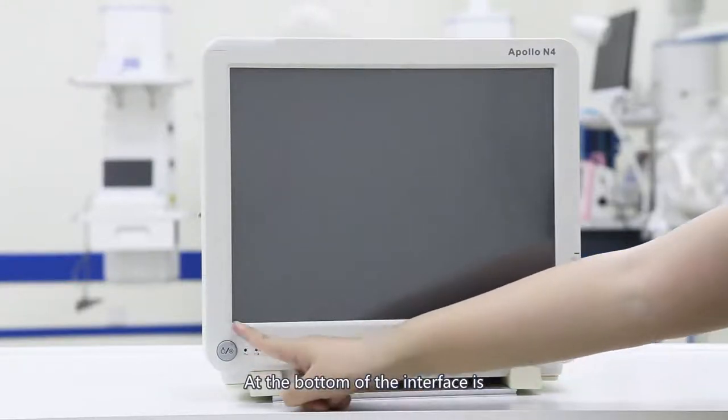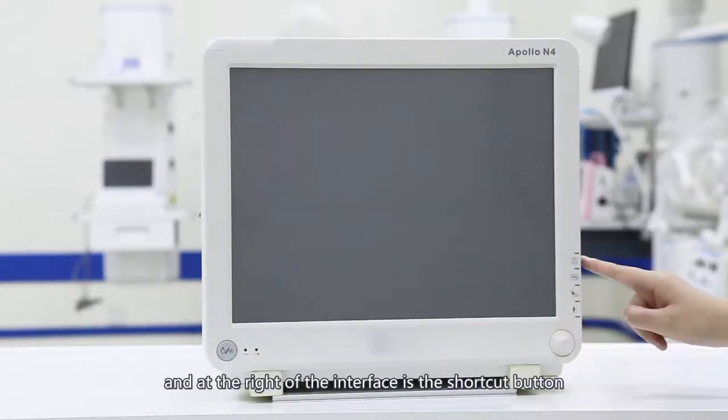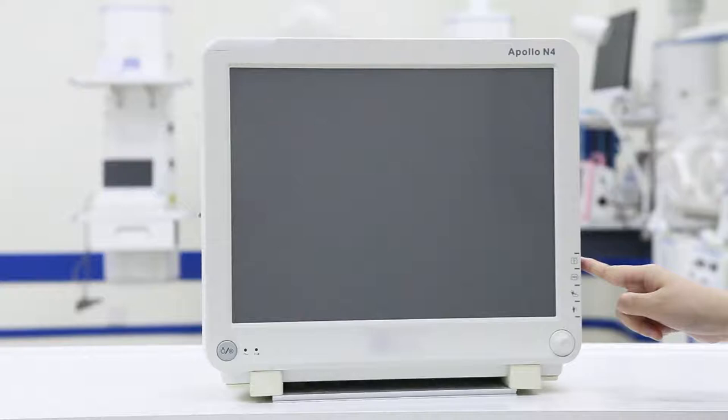At the bottom of the interface is the key to control the shutter. At the right of the interface is the shortcut button. The first is the record key. When the device is configured with the printer, pressing this key will automatically print the measured parameters.